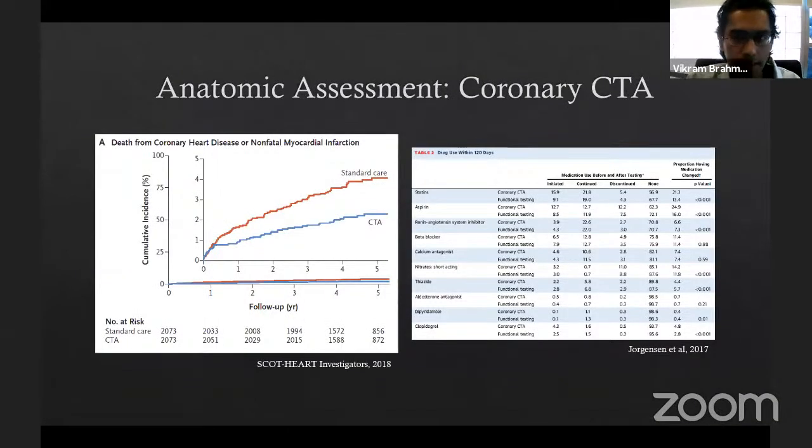So before I get into MRI, I think it's worth just revisiting coronary CTA. I read both, and I see the utility of both. In patients with stable coronary disease, with low to intermediate risk for obstructive disease, I think there's an excellent case to be made for a CT first strategy. And I think most cardiologists at this point are in agreement on that.